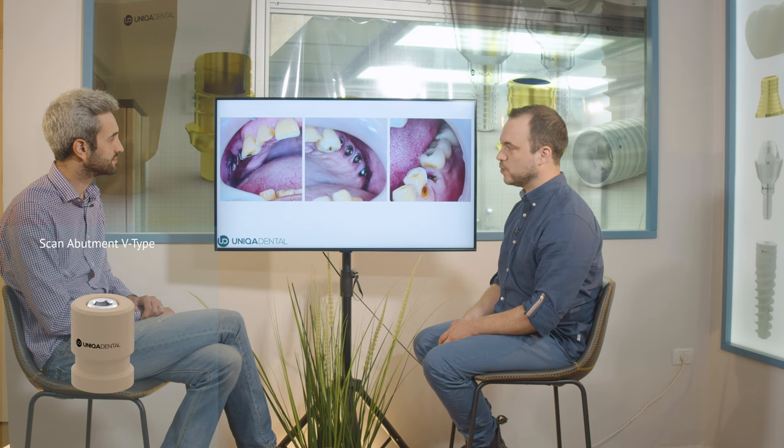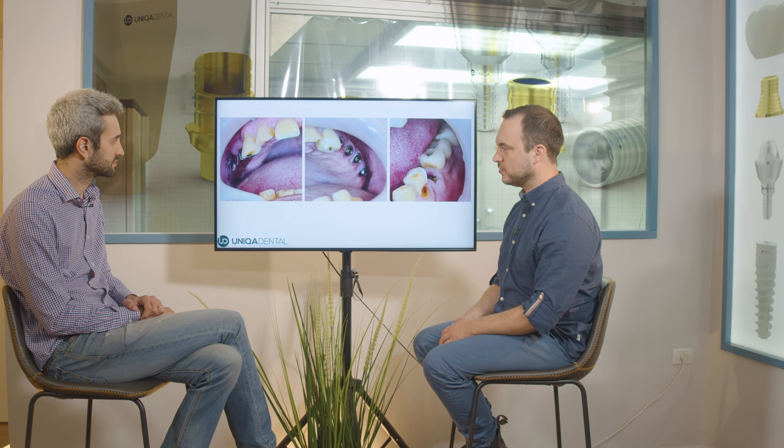We had one bridge on four implants on four multi-units, and another bridge on a partial bar and partial overdenture — the overdenture on the right side, the bridge on the left side. You can see the angulation of the implants: they're very buccally inclined, so the screw channels go to the buccal part of the crown.